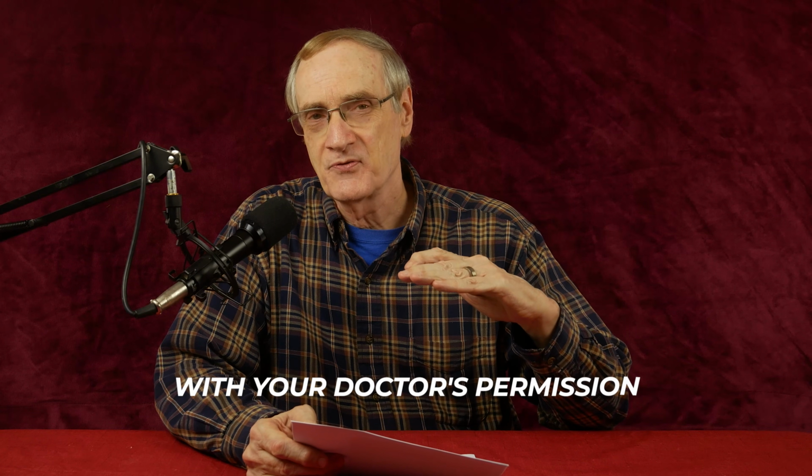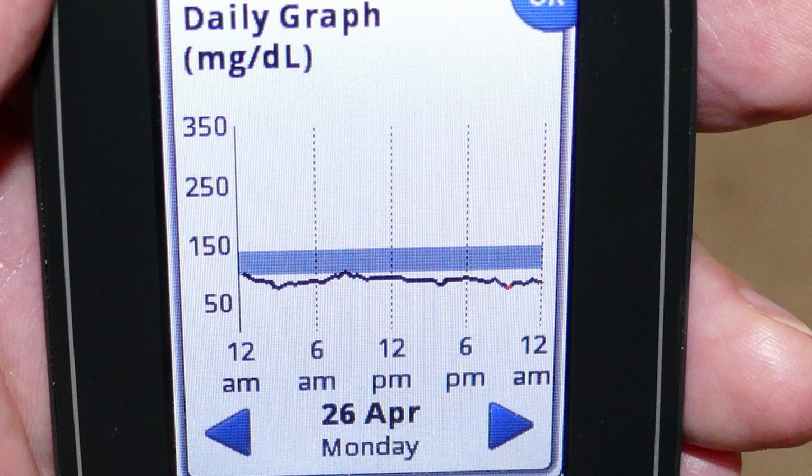Well, of course, this is one of the reasons you would want to fast, is to bring your levels, not only your glucose levels, but even your insulin levels, way down for an extended period of time. So here, as you can see from this graph, my glucose was below my targeted range, fairly significantly lower than that, all day long. And it would have been in the next morning as well, as we're going to see. So for Monday, I spent an entire day with glucose lower than normal. And that's a good thing. That's a positive thing. And I spent an entire day with insulin lower than normal as well.